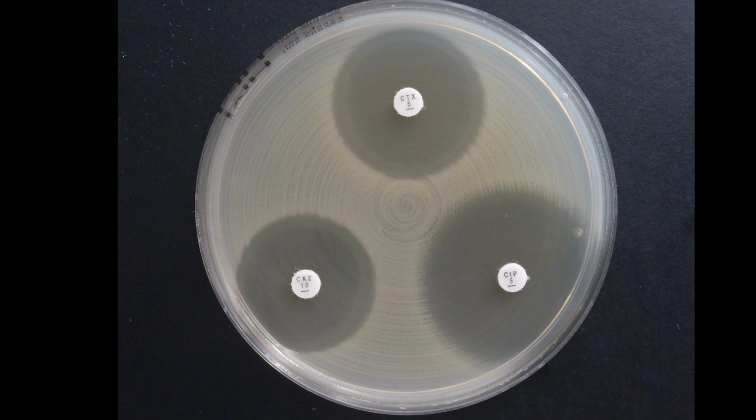And there we have examples for Stenotrophomonas maltophilia and trimethoprim-sulfamethoxazole, where it's very important to know that if you see any kind of zone, if the growth is cleared up, you should read that zone, even if it's not clear. For Staph aureus and benzyl penicillin, and for enterococci and vancomycin, you should read the zone diameter, but you should also look at the zone edge when you have a zone above a specific threshold. So those are also important to focus on, but I think that could be a second step after you have trained a little bit on the more general instructions.